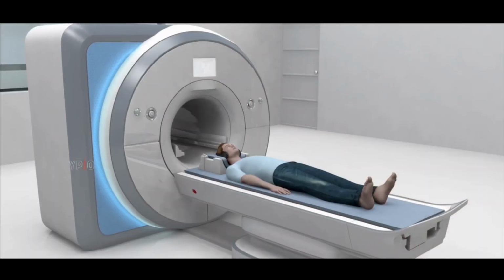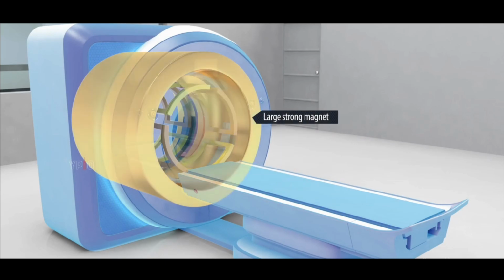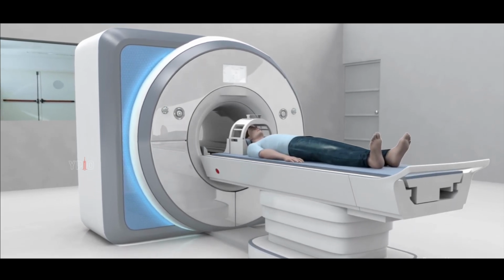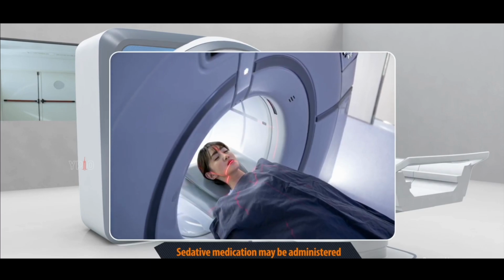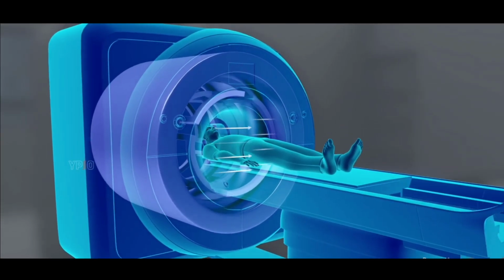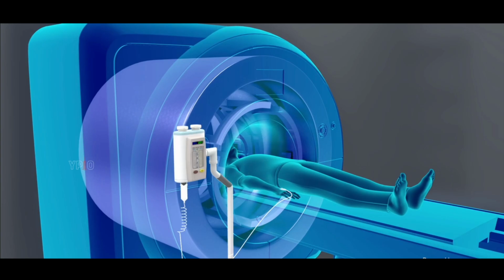Procedure. A typical MRI machine is a tunnel-shaped tube with a table that slides through it and both ends open. It is surrounded by a strong magnet. You are instructed to lie on your back on the sliding table that will move into the open tube. If you are claustrophobic, sedative medication may be administered to keep you calm during the procedure. A contrast dye, usually gadolinium, may be injected to improve the visualization of certain structures.